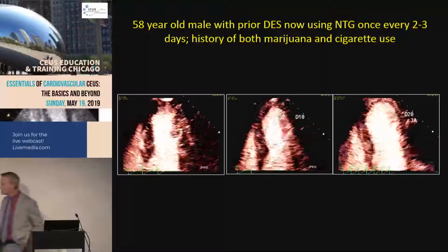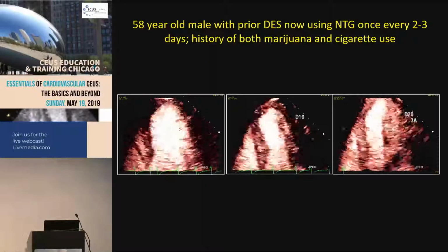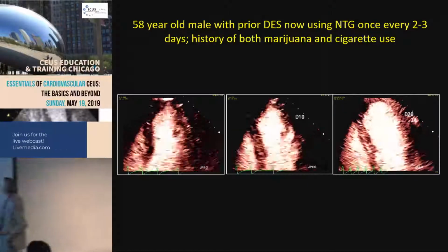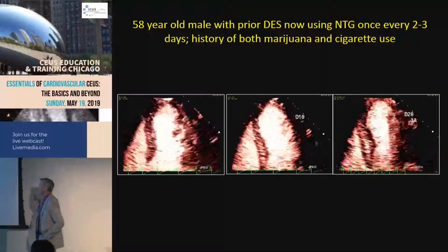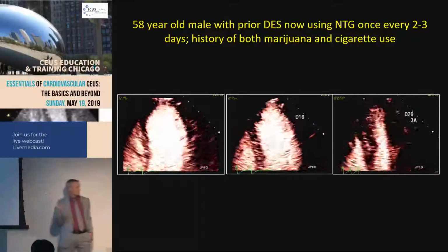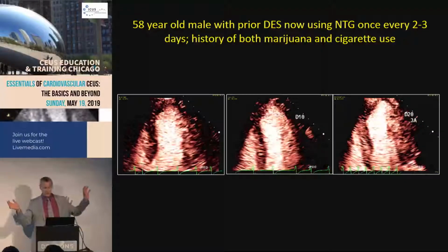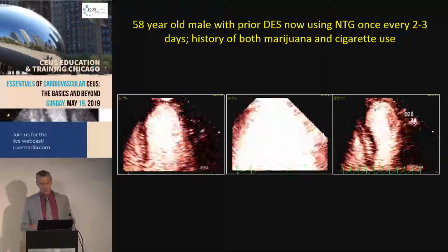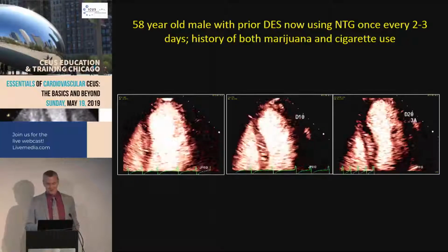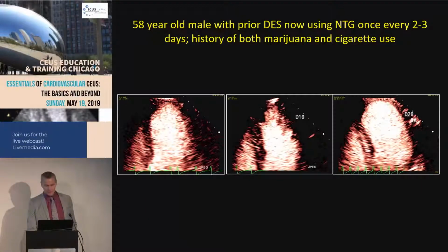And I think right after the high MI impulse, you can see this territory here in the distal septum and apex. To me, it looks like it almost becomes akinetic. You know, Tom, I would agree. Without your perfusion defect in the subendo. If you want to talk about perfusion, Steve wants to talk about perfusion, I do too. We're just talking about LVO, all right, okay? I agree. It's more impressive. So yes, and that's what we thought too.